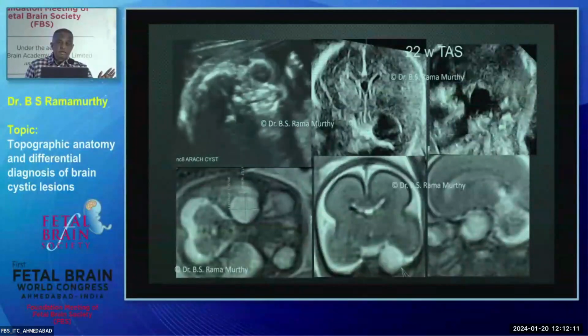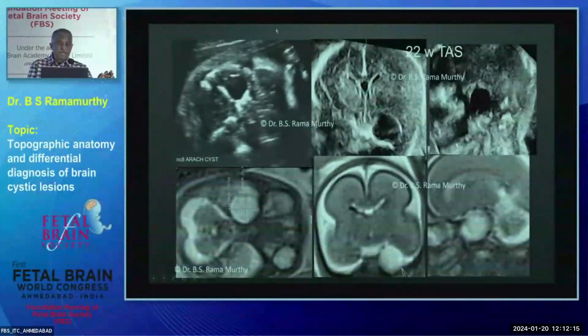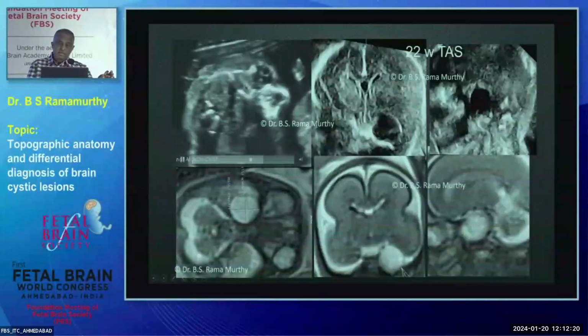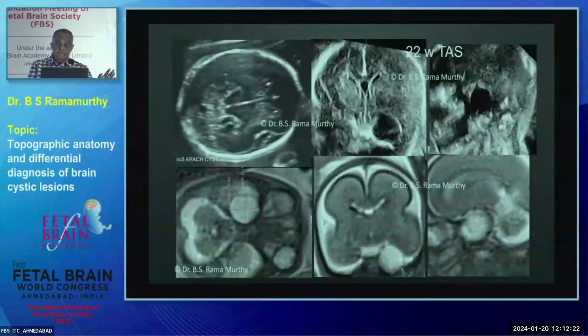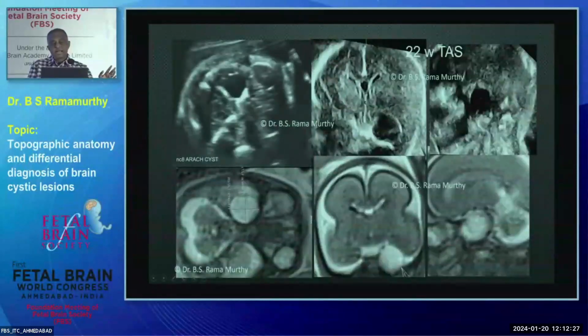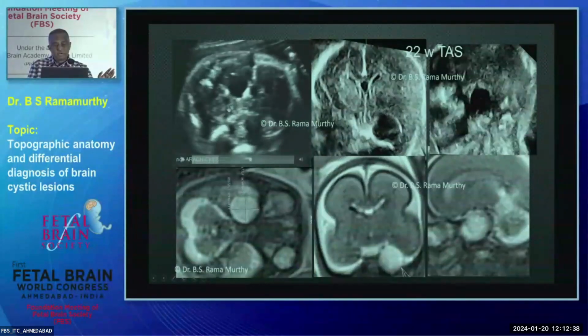Again, look at this. This is a sweep that is important. And as I'm doing this sweep, can your eyes pick up the cyst there? Yes, that should goad you into doing a multiplanar. And in the multiplanar, I'm showing you the coronal. This was a head up. I couldn't do a vaginal scan. And on head up, I know that this is the tentorium, this is the cyst, and this is the place where it is in the axial view. And in the parasagittal view, not a great view, but I could get this only from the volume.